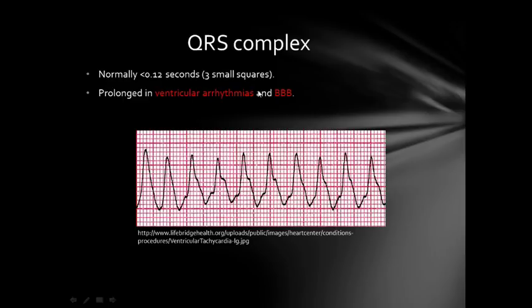The fourth thing is the QRS complex. Normally it is less than three small squares in width. It is prolonged in ventricular arrhythmias and bundle branch blocks. For example, ventricular tachycardia — since it is ventricular in origin, the QRS complexes are wide, definitely more than three small squares. This is ventricular tachycardia.